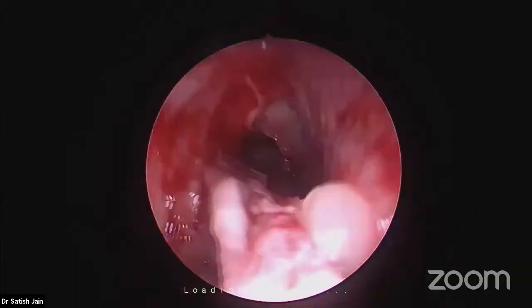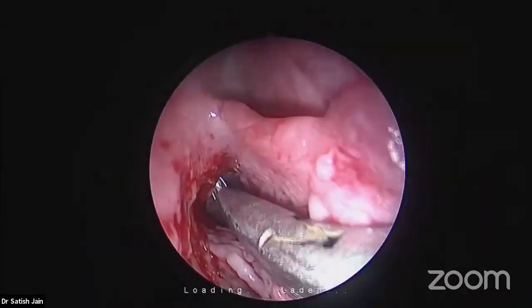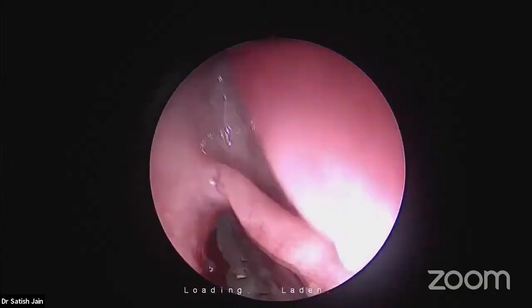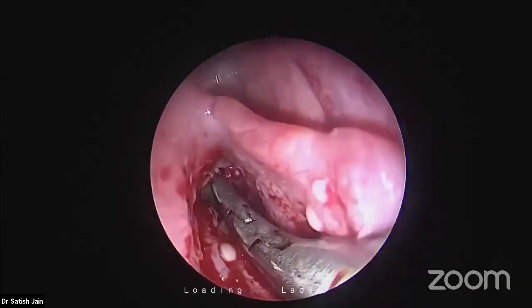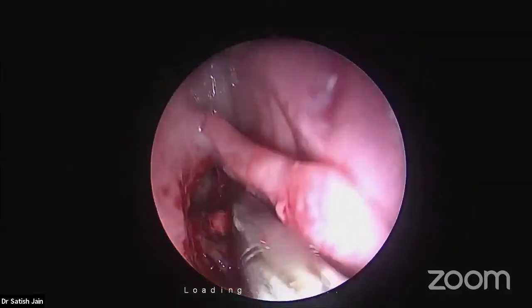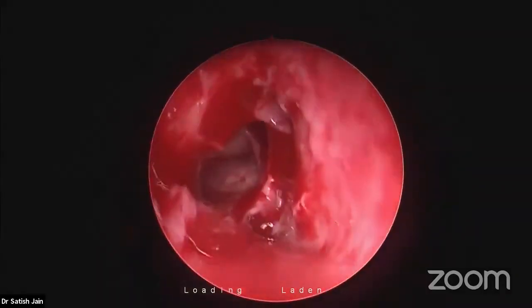Number one. Now I can enlarge this beak with a special instrument. I love this instrument. This is Satish sir's special instrument. Satish sir, so nicely you have given the point. We have been working for many years for inventing always a different instrument for frontal sinus surgery. See now, what more frontal is coming in the way.